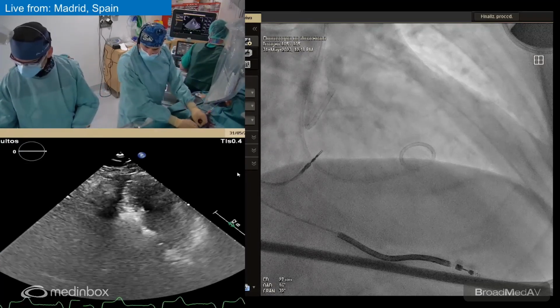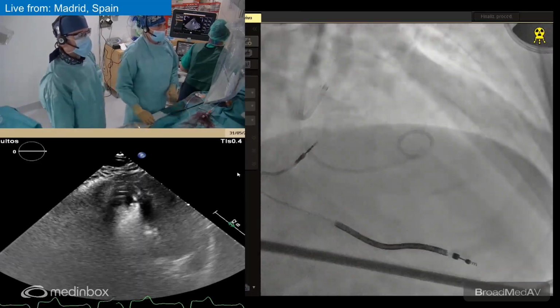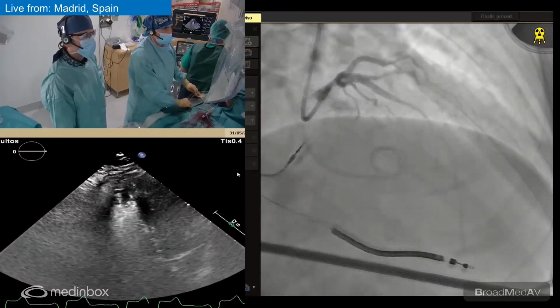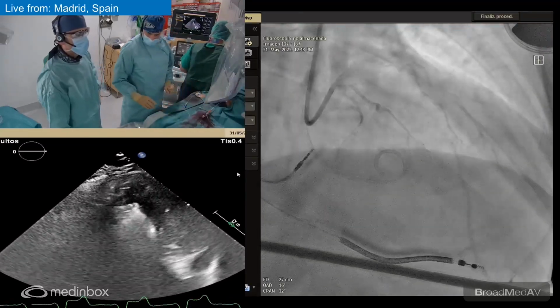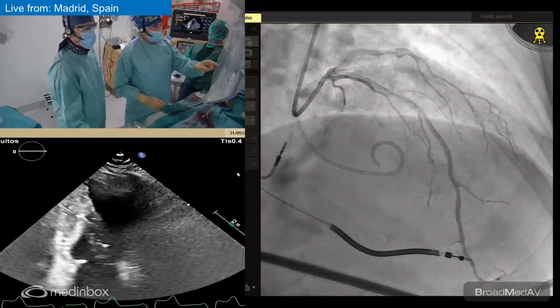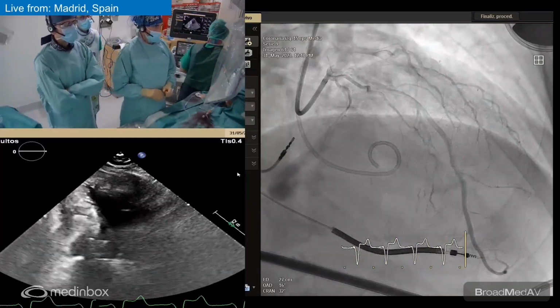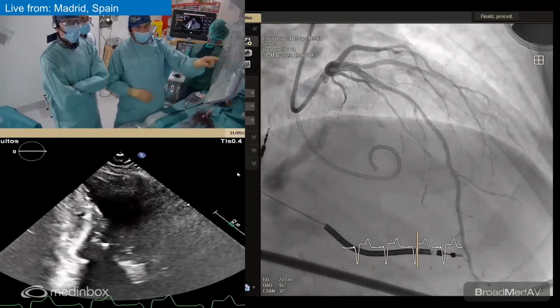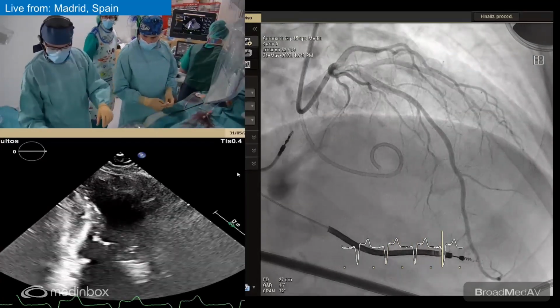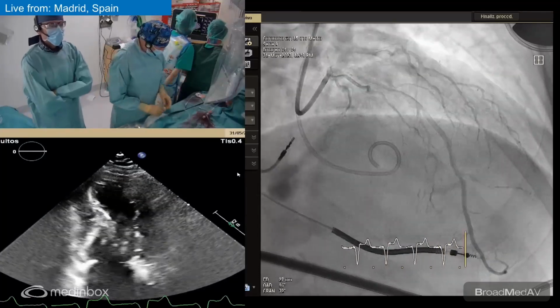A test to check the LAD flow. Okay. Yeah, we can see we have ablated all the septals. The two septals that we have treated are occluded. Let's try the first. Yeah, okay? Let's go. We can go with the balloon and the wire inside the balloon at the same time because we avoid the trapping sometimes.